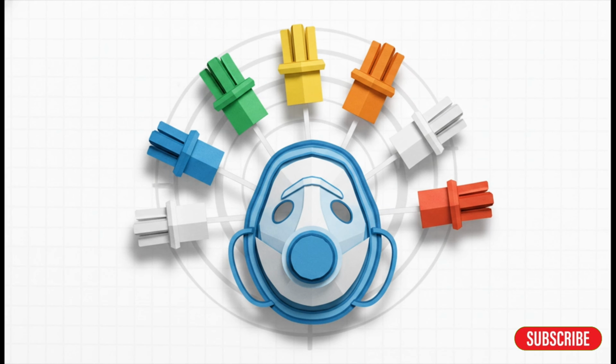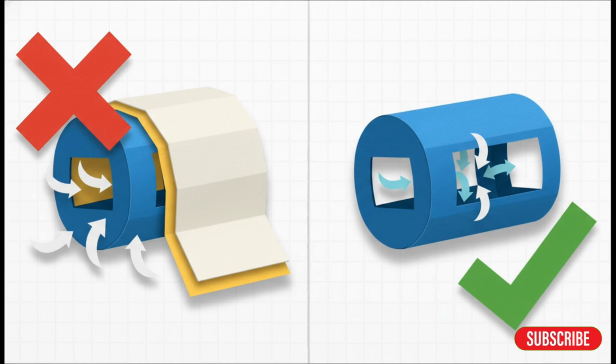The magic is in these little color-coded adapters. Each one is designed to pull in a specific amount of room air and mix it with the oxygen to deliver a locked-in, exact FiO2. So remember, this mask delivers a fixed FiO2. And this is so important for patients with conditions like COPD, because they can actually retain CO2 if we give them too much oxygen. But here's the critical part.